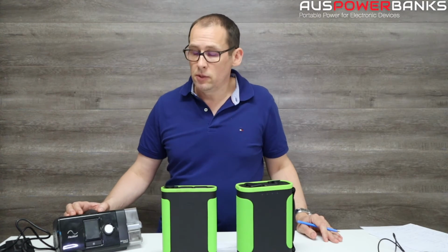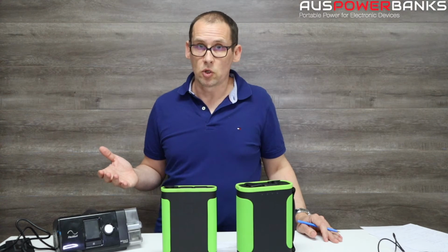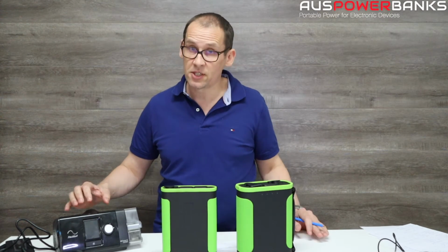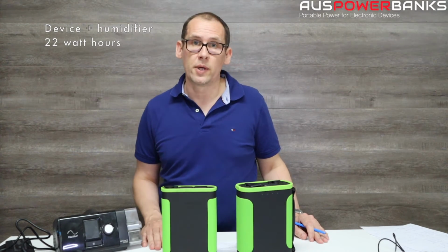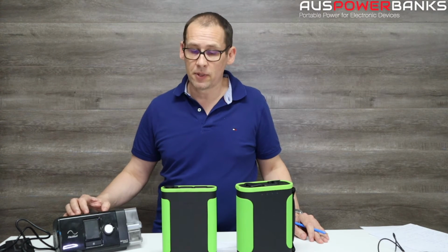Now when you start to use a humidifier or even a heater, your watt hour consumption is going to go right up. So with this ResMed, for example, just with the humidifier, it jumps from 7 watt hours up to 22. So every hour it's using 3 times the amount of power. So that's something to keep in mind.